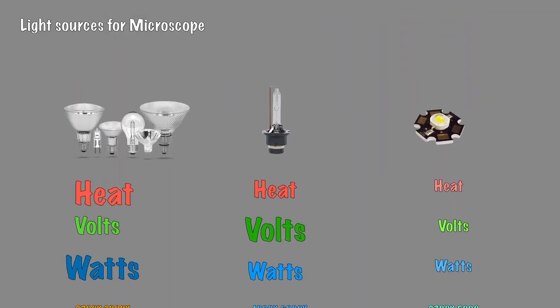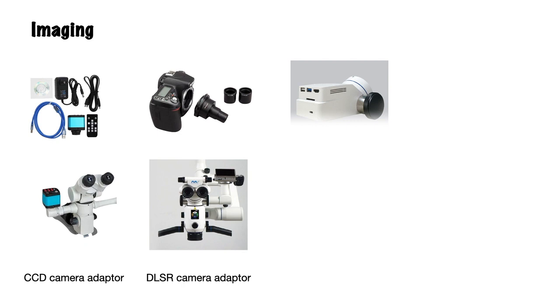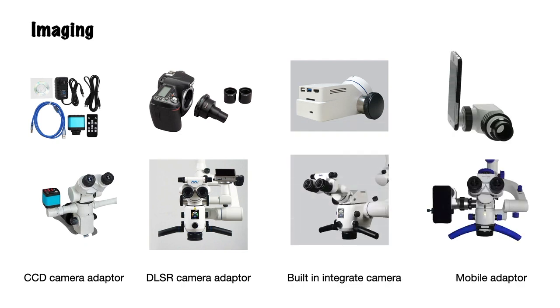Okay. So about the imaging part, which is the final point in this part of the presentation: I talked about ergonomics at the beginning, that the dental operating microscope is the best choice for the dentist to pay attention to ergonomicity and physical disorders.